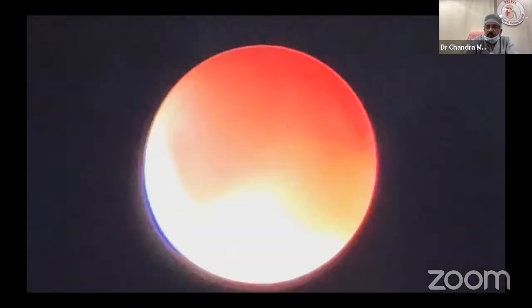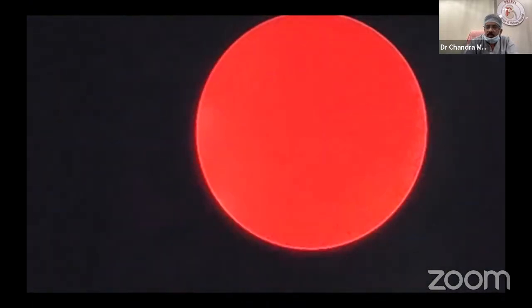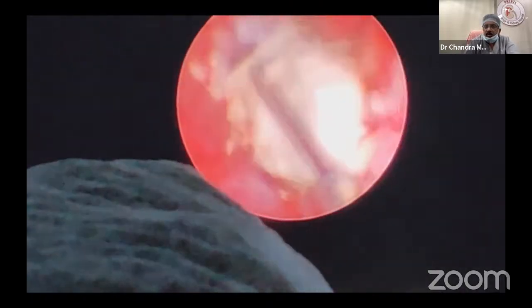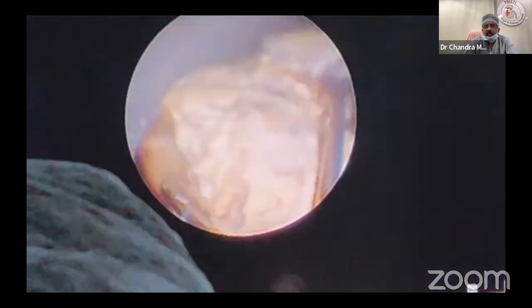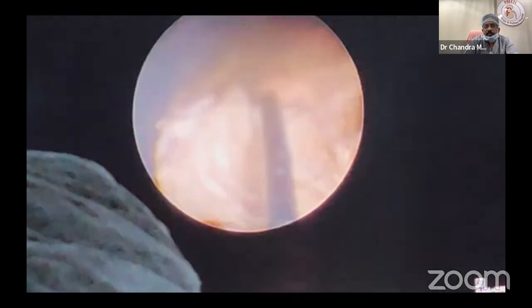You should not use laser in such cases. See, nicely you hold, rotate. See, this is a very important step in PCNL. Rotate. Don't try to pluck out. Plucking out is wrong. Rotation is correct, like this. If it is not coming, happily you break.